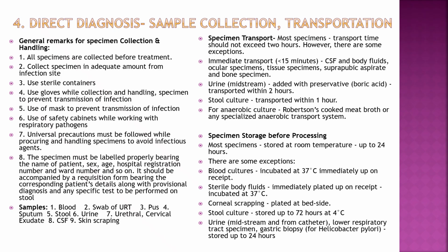Specimen transport. For most specimens, transport time should not exceed 2 hours. However, there are some exceptions. Immediate transport within 15 minutes for CSF and body fluids, ocular specimens, tissue specimens, suprapubic aspirate, and bone specimen. Urine with a preservative like boric acid is transported within 2 hours. Stool culture is transported within 1 hour. Anaerobic culture is transported in Robertson cooked meat broth or any other anaerobic transport system.